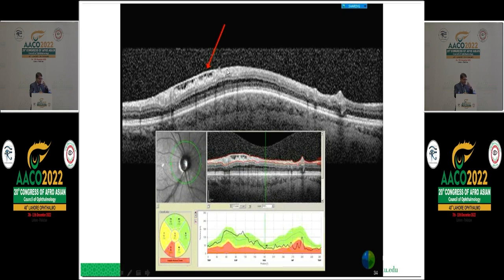Recently he shared a nice paper from Frontiers in Ophthalmology, which looks at subtracting out the effect of the epiretinal membrane and trying to improve the quality of the scan. The problem here, of course, is that the membrane may also stretch the photoreceptors and the other layers of the retina and affect them, not only structurally, but functionally as well. But here, the epiretinal membrane is creating an artificially thick retina. So if you look just at average numbers, you may say to yourself, this looks fine. But in reality, there are some thin areas, you see.